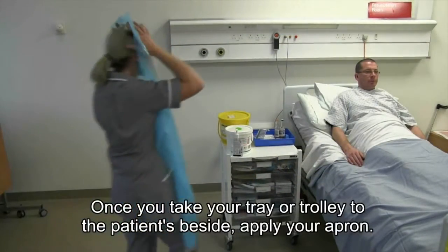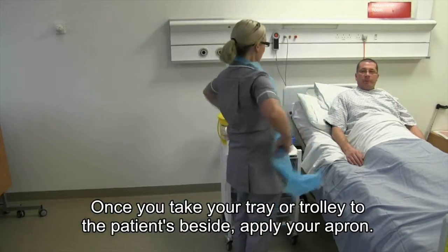Once you take your trolley or tray to the patient's bedside, apply your apron.